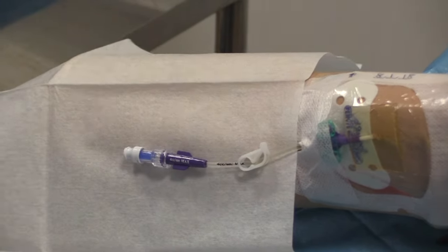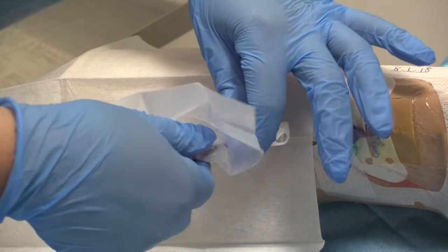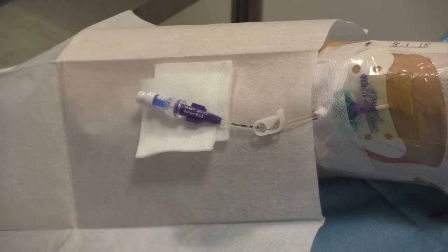Taking the Clinell device wipe, using the hole of it and using the scrub the hub technique, clean the needle-free valve for 30 seconds. Allow to dry over some sterile gauze, protecting the valve and ports and the key parts.